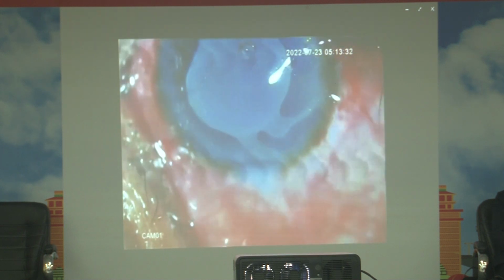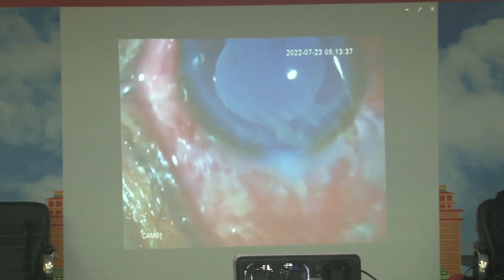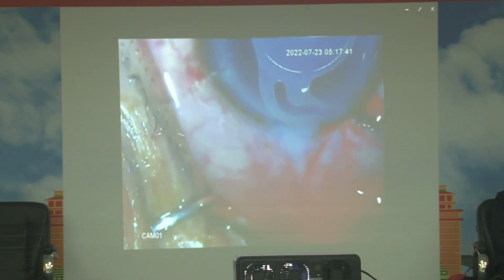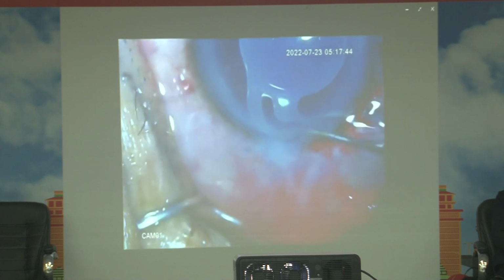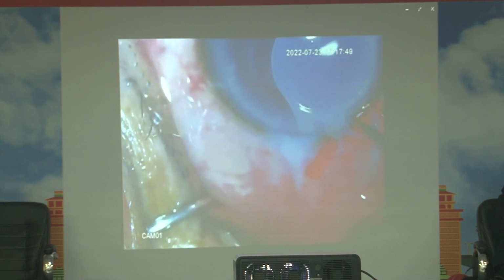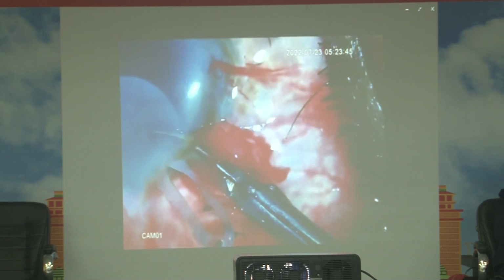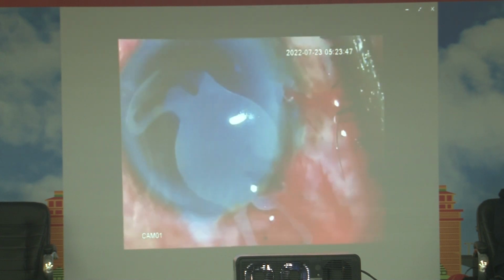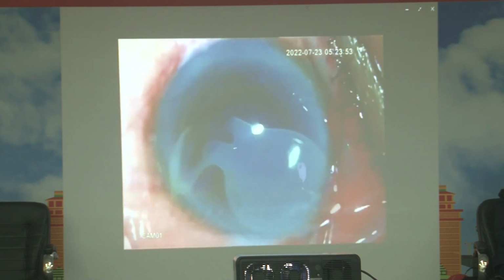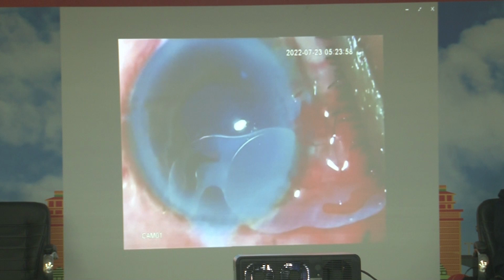But this is a very tricky technique, because if it is very well adherent, we may lose the PC. So it's better to lift the IOL from the junction of the optic and haptic. If you can move it, slowly dial one at a time out of the bag, and then after forming a good AC, you can take out one of the haptics from the main wound and then cut the IOL, either through and through, full thickness, totally or halfway, and then slowly dial it out, slightly stretching the wound, not enlarging it.